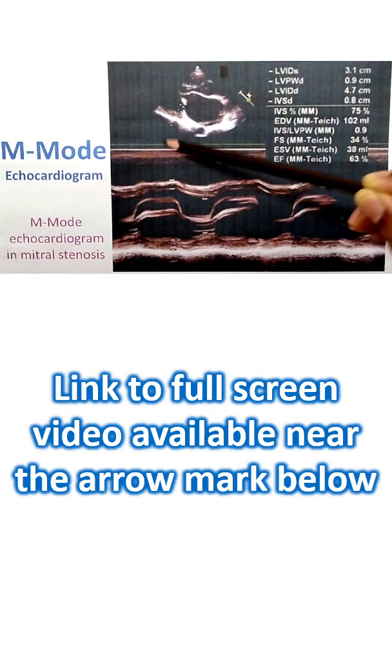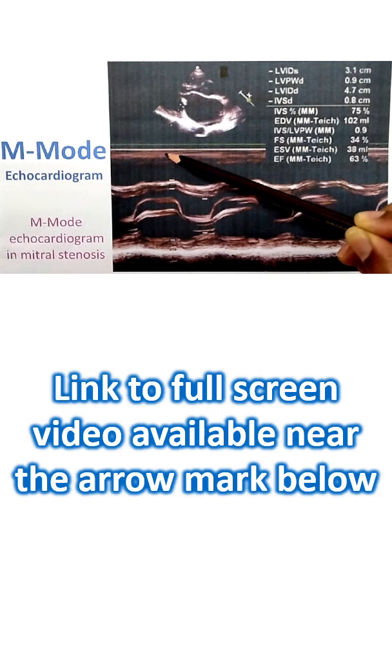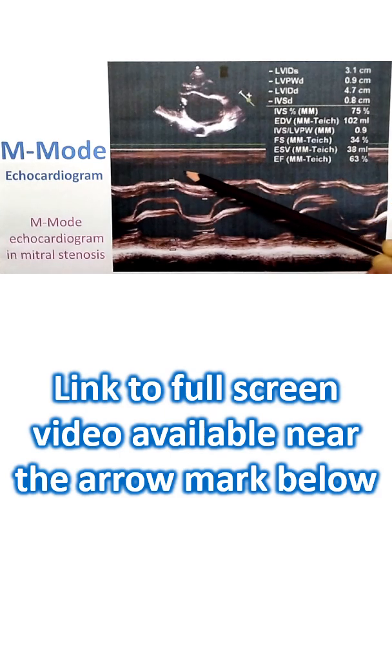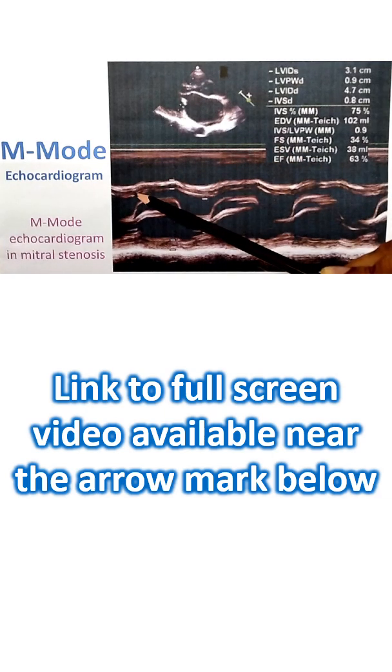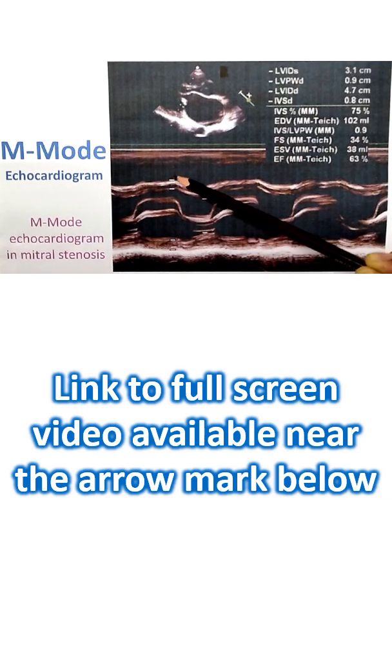This will be the anterior chest wall, free wall of the right ventricle, portion of the right ventricular cavity mostly in the right ventricular outflow region, and this is the interventricular septum. You can see that anterior and posterior parts of the interventricular septum has been marked here; that's for the left ventricular measurements.